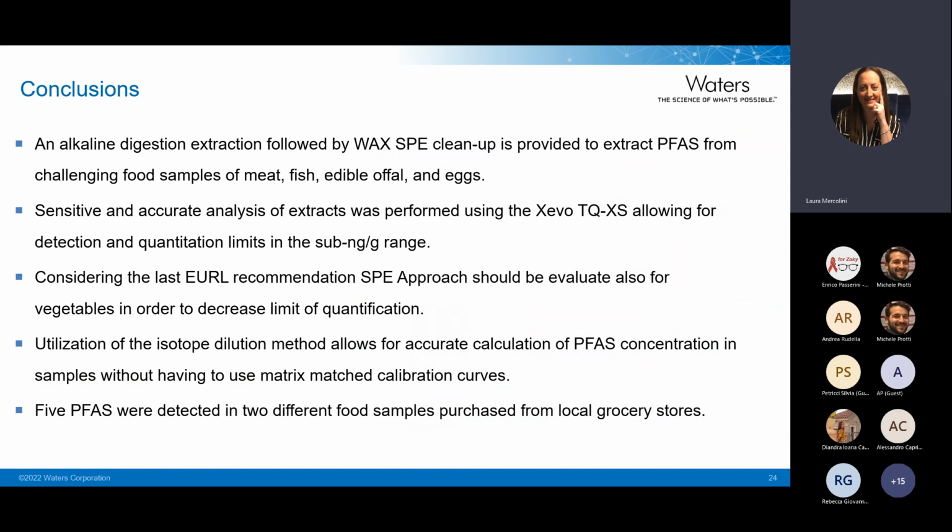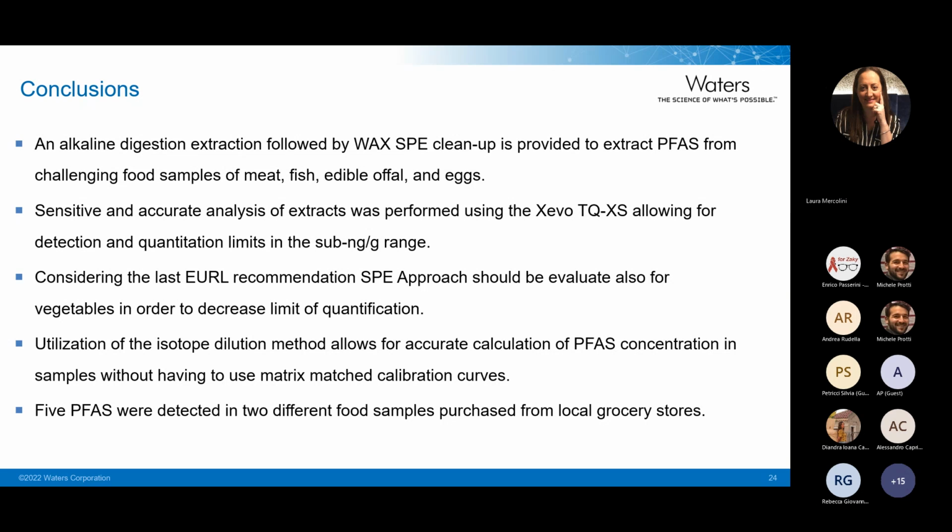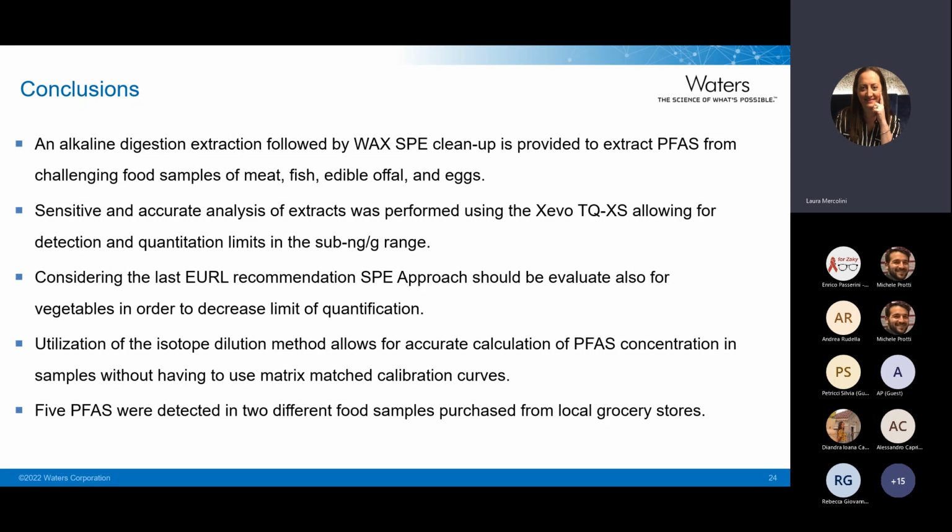So, to conclude, the use of SPE is recommended for fatty matrices, and regarding QuEChERS, it depends. It depends because regulations are changing, and we don't know which kind of vegetables. Anyway, we are ready because we have already prepared 2 different protocols, and we have the solution for each matrix.